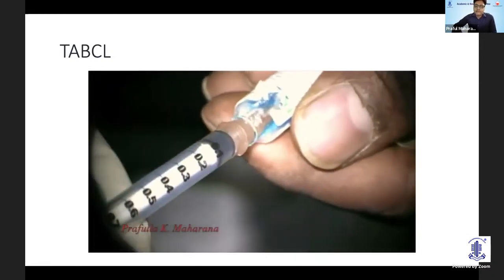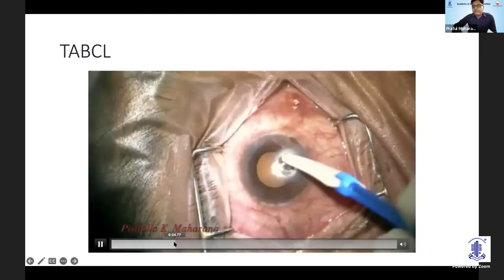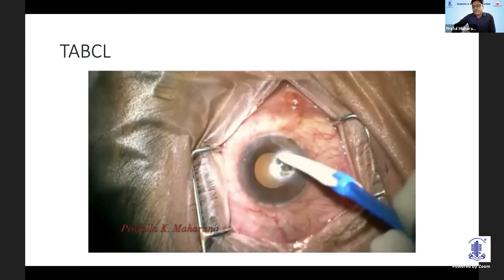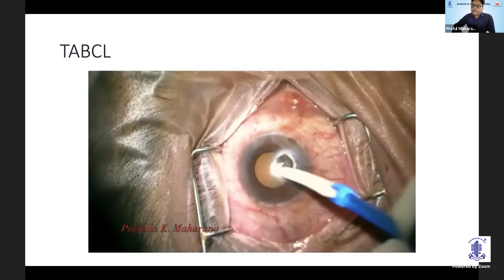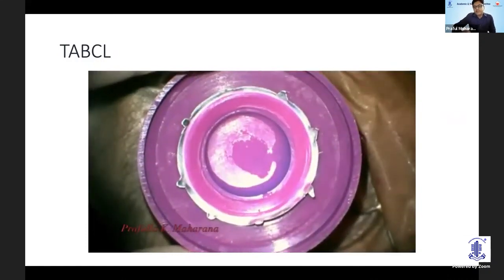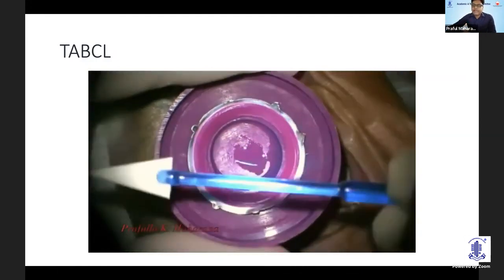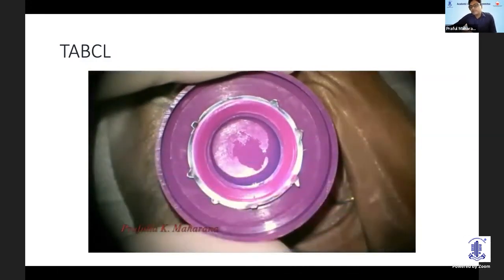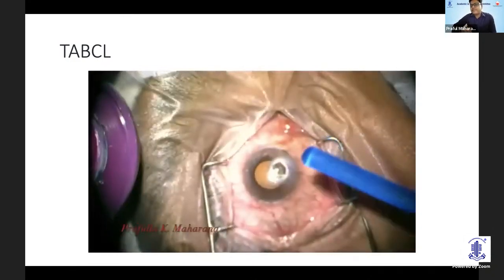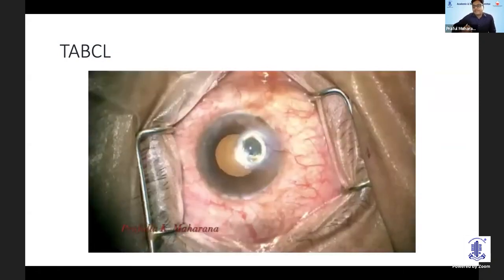This is the cyanoacrylate — histacryl glue that we use at our center. This was a case of Descemet's membrane exposure. An important trick is you have to debride the epithelium surrounding the area of perforation or the Descemet's exposure. People prefer to use a 30-gauge or 23-gauge needle, but my preferred procedure is to take any blunt instrument, just touch the glue, and apply it to the surface of interest.